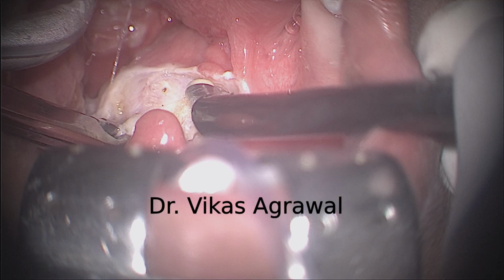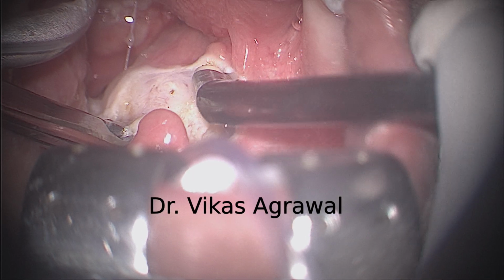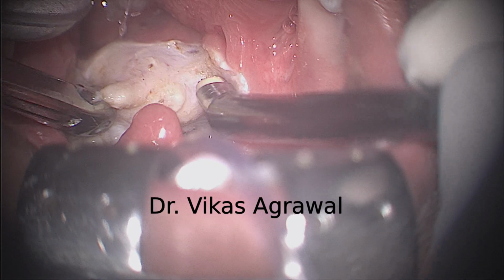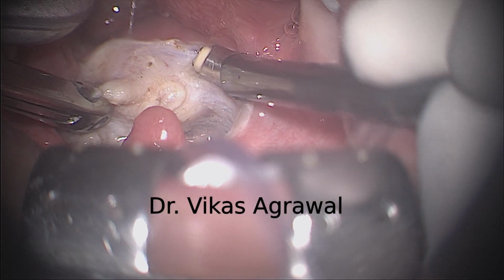Now, this is the lingual tonsil starting. This is the lingual tonsil outside the palatine tonsil.